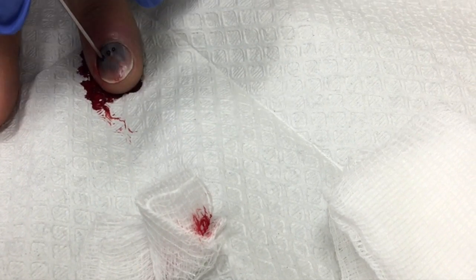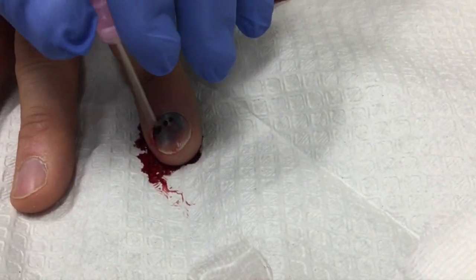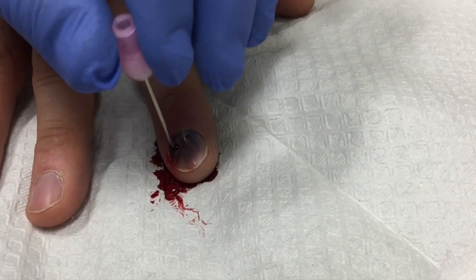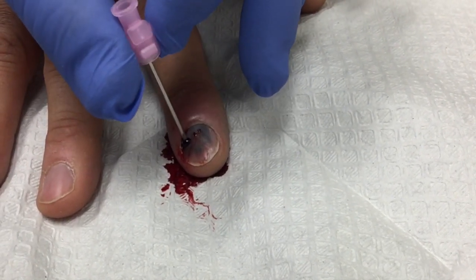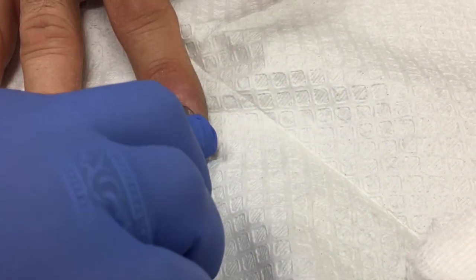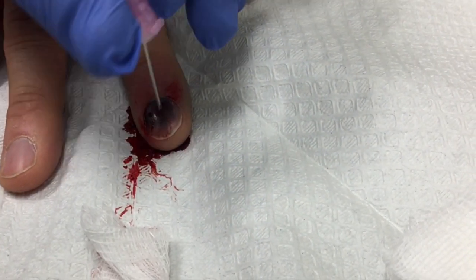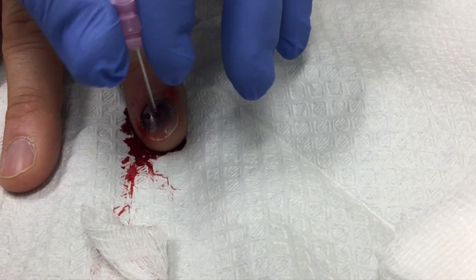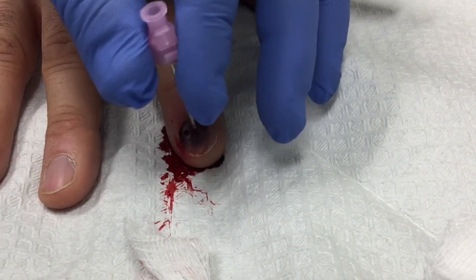Good man, good man. There we go — you okay? Sharp? Not much. I don't want to push hard. I'm gonna go one more area that looks like the most pooled. The little holes will hopefully continue to drain, and eventually the nail will grow out — sometimes it might fall off with the blood underneath it, the nail may lift.